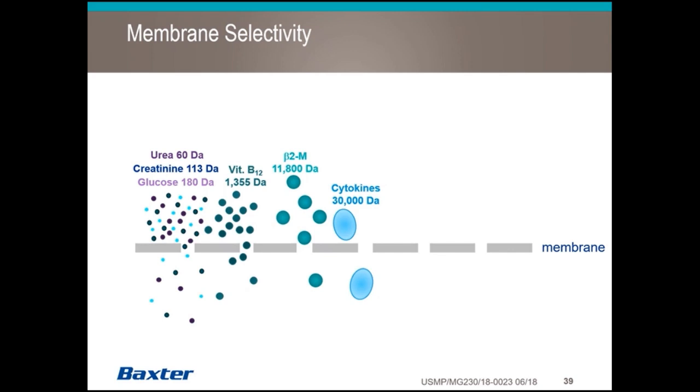Remember from a previous slide, we talked about dialysate and diffusion, and that diffusion only clears these small molecules. So when you're doing intermittent hemodialysis or you're using just dialysate solution, you're going to be targeting molecules of this size. Depending on the modality or the therapy that the doctor orders, that we're going to be discussing very briefly, you'll be using convective therapy as well, using replacement solution, which will be able to target these larger molecules that can't be removed with a dialysate or diffusion alone.